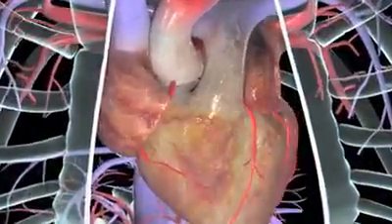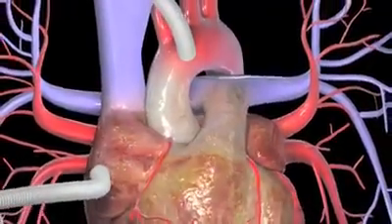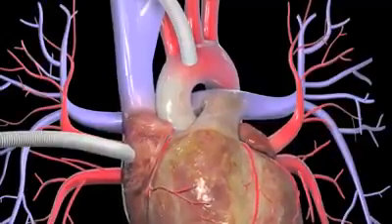You'll be hooked up to a heart-lung machine, which does the work of those organs during the surgery. This way, your heart can be stopped while the surgeon sews the artery grafts into place.